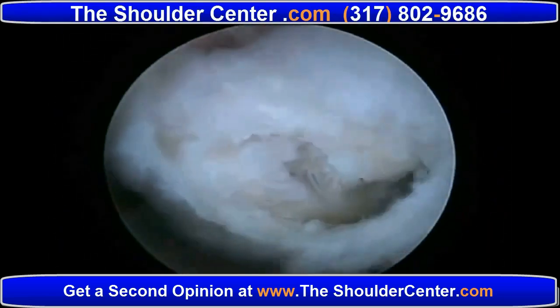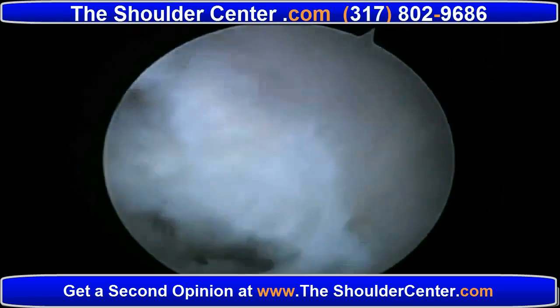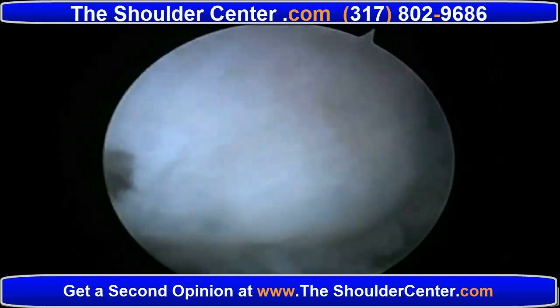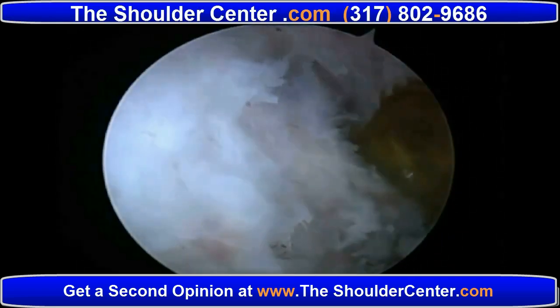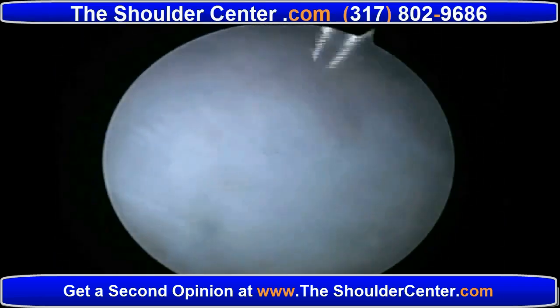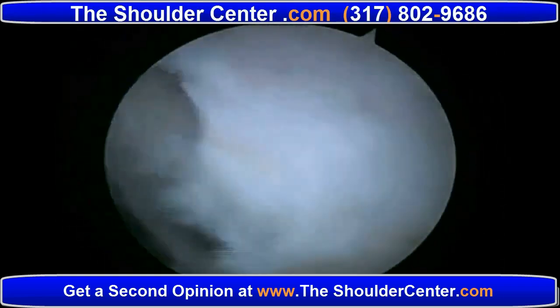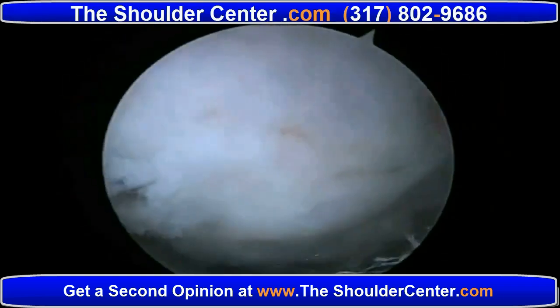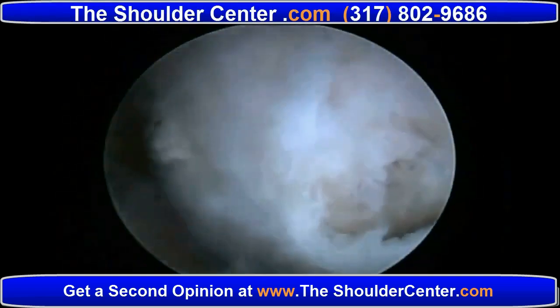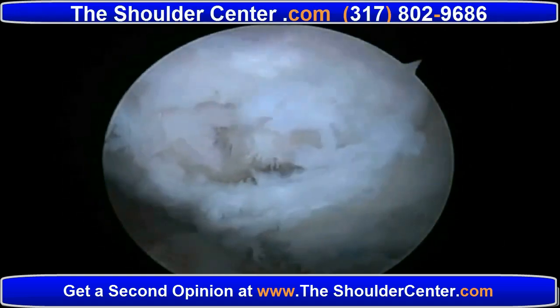We can see that the tear here is anterior to the previous rotator cuff tear that was repaired with the graft. We can see that the graft is nicely incorporated and has given us a better quality of rotator cuff tendon. Once we've done our preparation, we establish a twist-in cannula in the posterolateral and anterolateral quadrants to allow instrumentation along with our posterior and anterior cannulas.